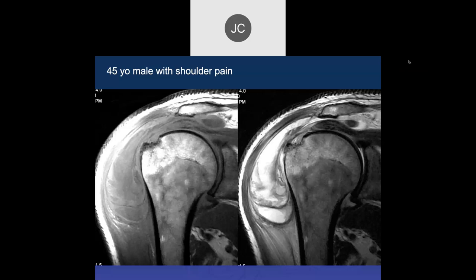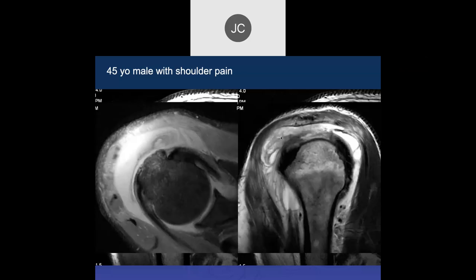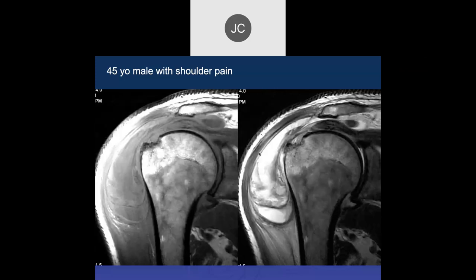We have a 45-year-old with shoulder pain. It looks like there's a tear of the supraspinatus and then there's a huge subacromial/subdeltoid effusion with maybe some hemorrhage in there or synovitis. This is a big tear. This isn't the usual effusion we see — synovitis or maybe infection.